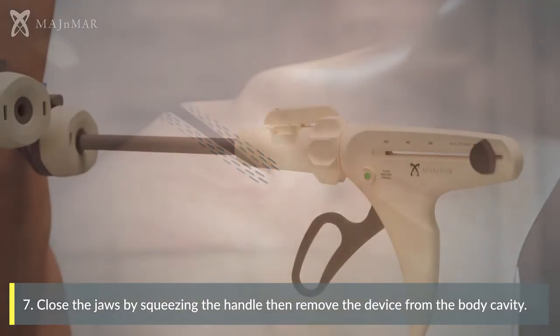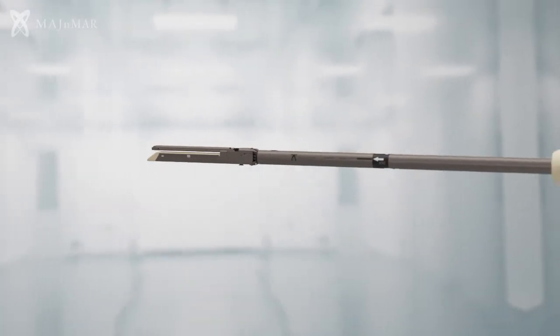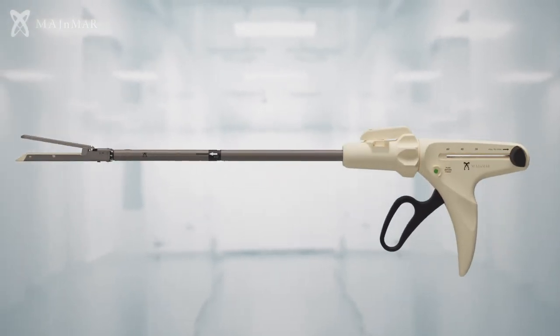Close the jaws by squeezing the handle, then remove the device from the body cavity. Unload the reload from the stapler.